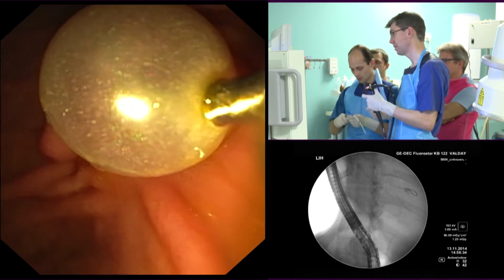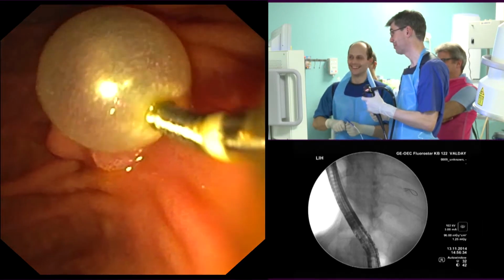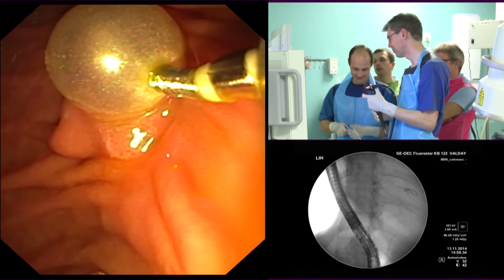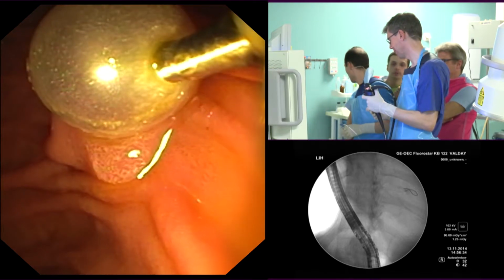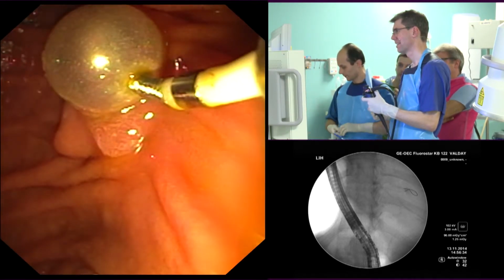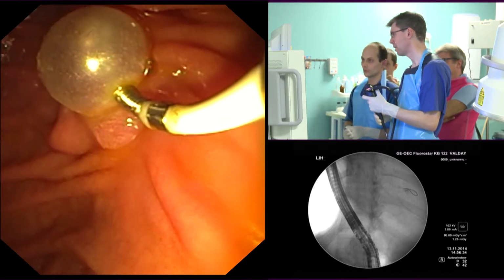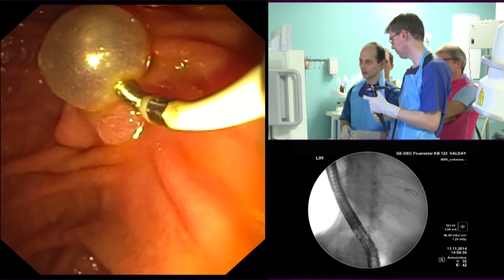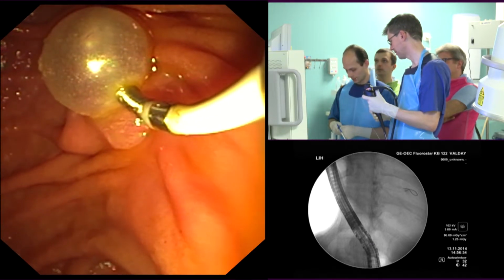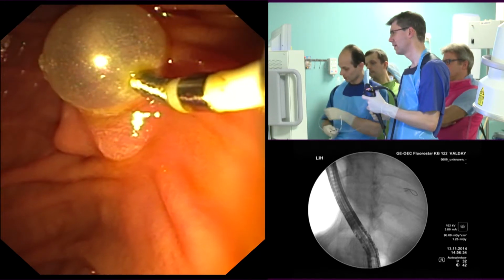You won't get the air out. How to deflate it? That's the problem, because there's this valve inside. There's a needle somewhere. Let's cut it. Inflate this, but not deflate this. Yes, but we try to maybe cut it, and we have a special needle to inflate it again.